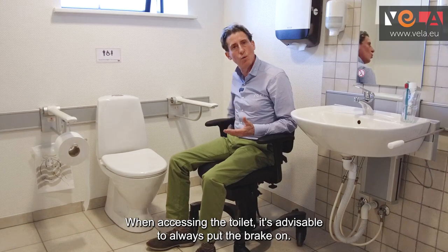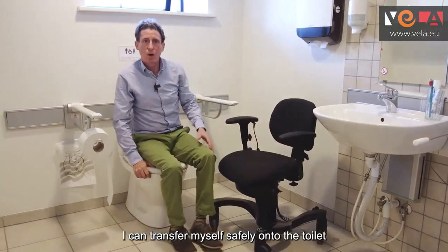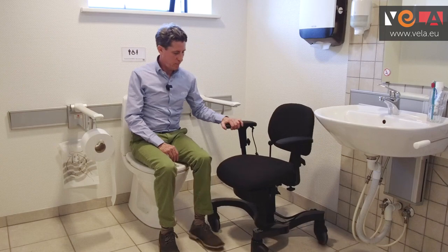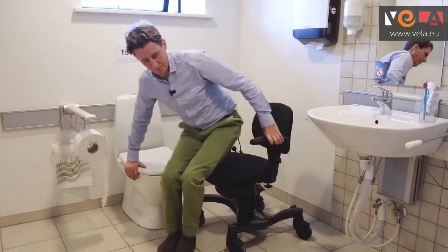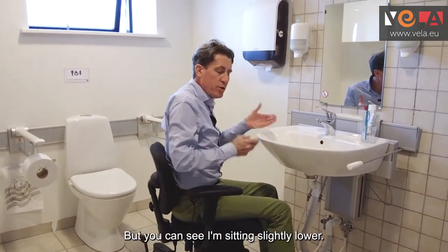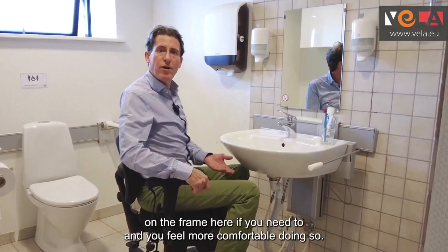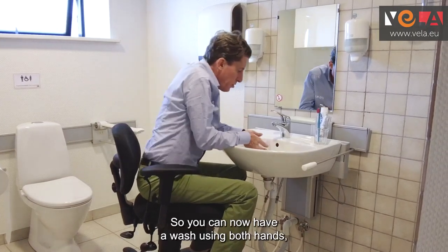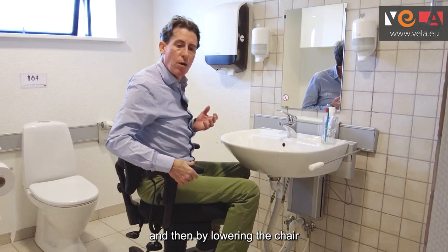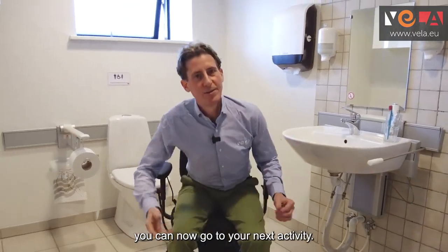When accessing the toilet it's advisable to always put the brake on. Using the strong arms here I can transfer safely onto the toilet, and by using the Vela chair and lowering it a little I can now safely transfer back to the chair. Then by releasing the brake I can go and wash my hands and clean my face. I'm slightly lower, so I apply the brake, use the high-low, rest my feet on the frame if needed, and I can now have a wash using both hands — indeed brush my teeth — then lower the chair, release the brake and go to my next activity.